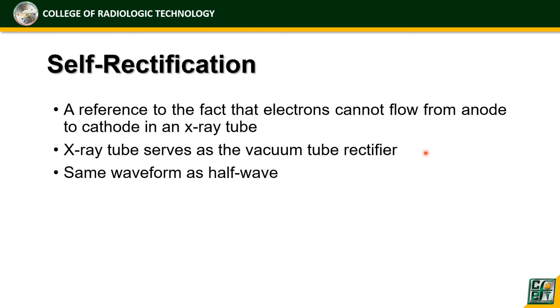Kaya nga siya ay self-rectification. And the waveform for self-rectification is the same as half-wave rectification with 60 pulses per second or 60 cycles per second.